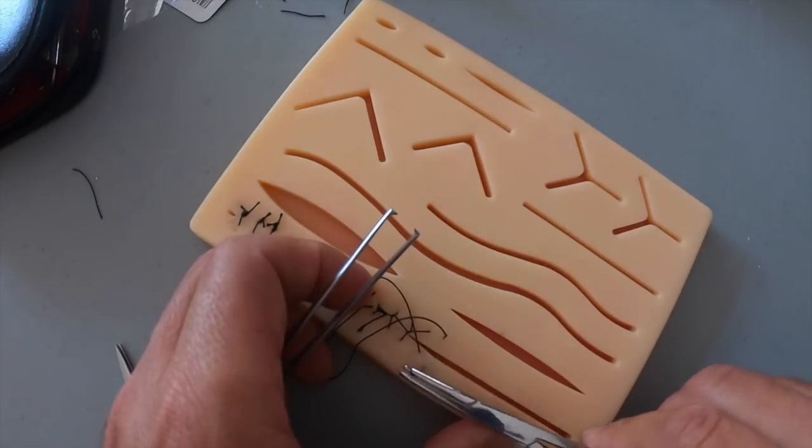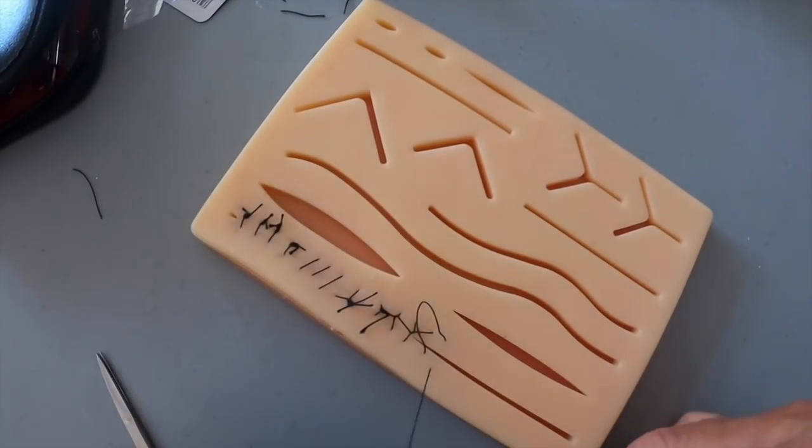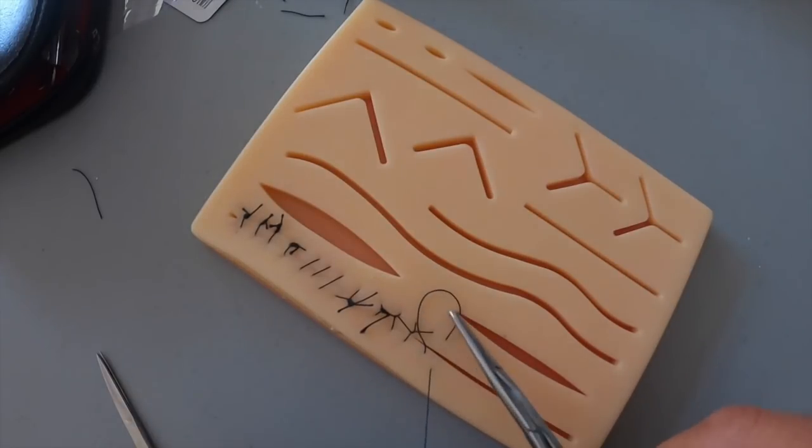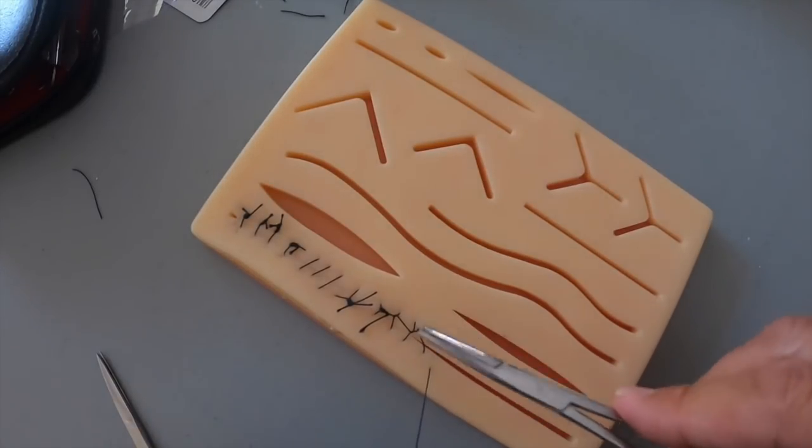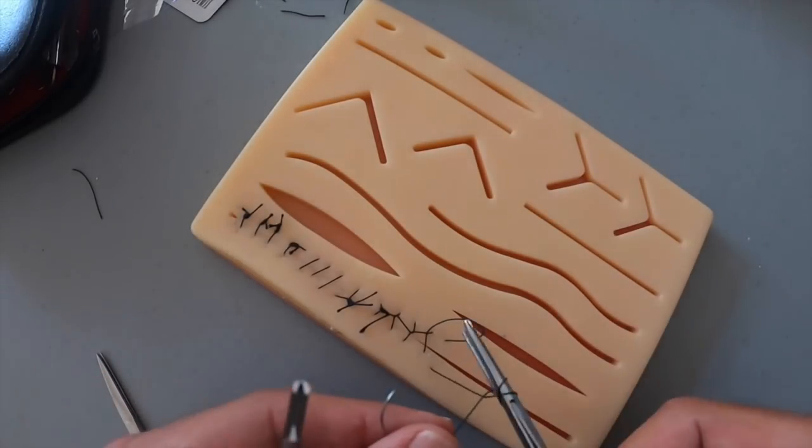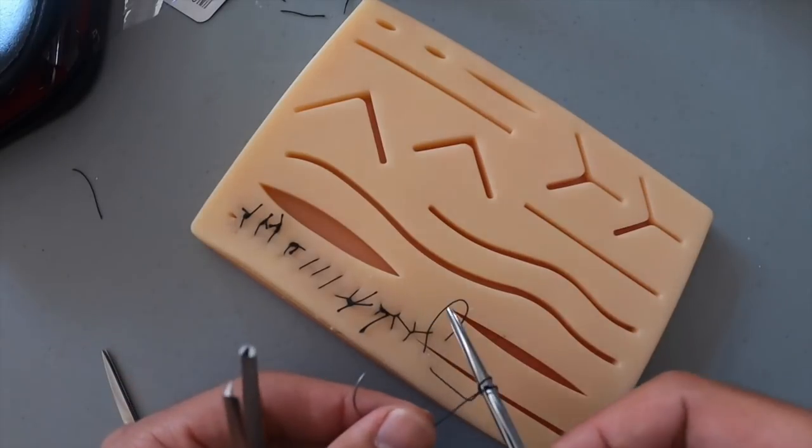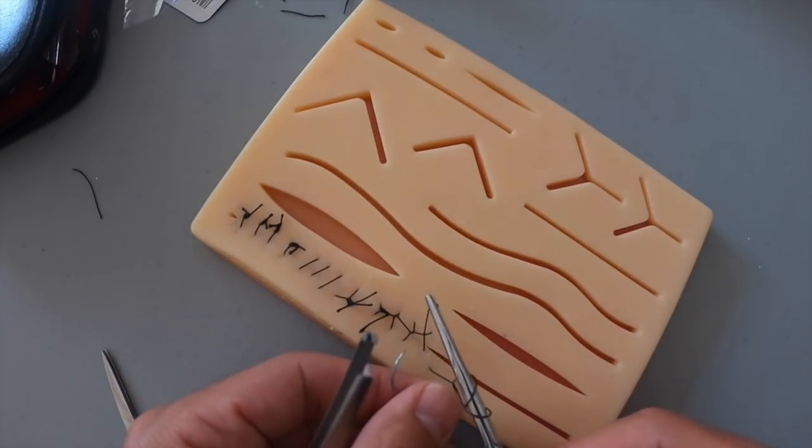All right, so this one just like with the continuous but not the interlocking, you leave that last loop and you're not going to come through. That's the one you're going to use to tie and make your last suture or stitch. So you go twice around and you grab your loop like that, pull it tight.